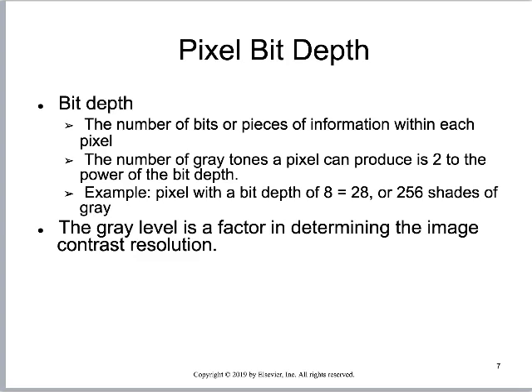So if my hand is an X-ray, and this is the patient's body, I'm seeing everything from here to here, right? I'm seeing all of that. All of this is being put in a little pixel drawer. All of those attenuation values that the beam is picking up as it passes through the patient are being dropped in a little pixel drawer on the image receptor matrix. The more we can drop in the drawer, the deeper the pixel bit depth is. The more we can drop in that drawer, the more attenuation values we can express, the greater that bit depth is.